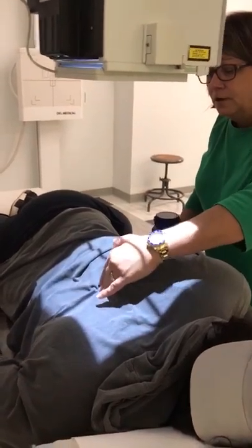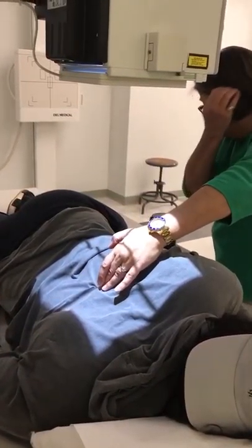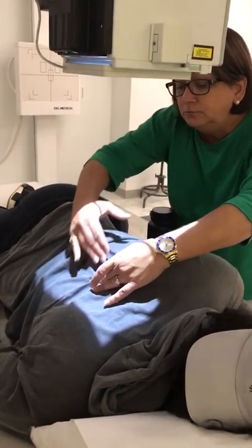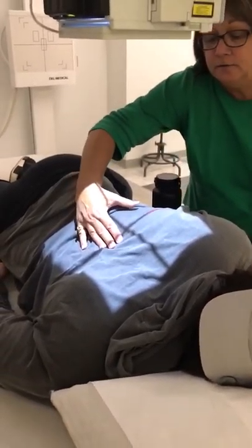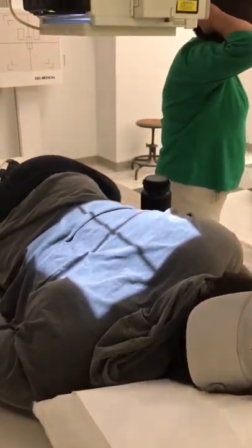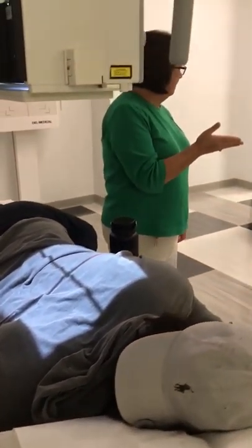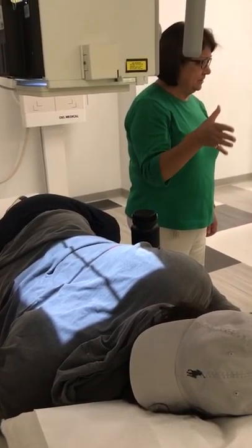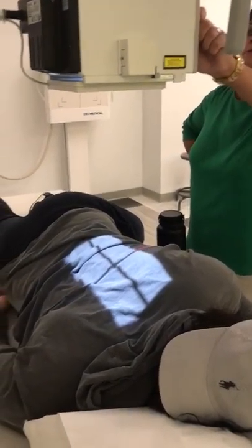So now I'm going to locate the spine and I'm going to center 2 inches lateral from midline. So I'm centering 2 inches away from the mid-sagittal plane toward the elevated side, toward the patient's left side. I'm collimating again to 6 inches.